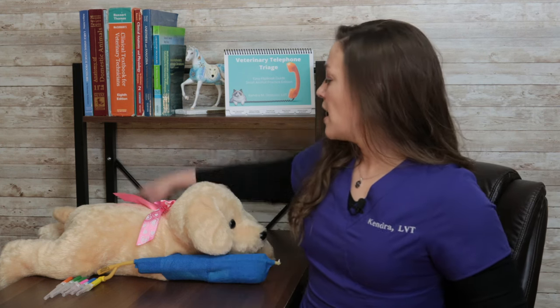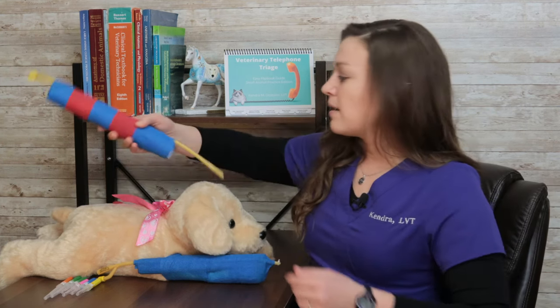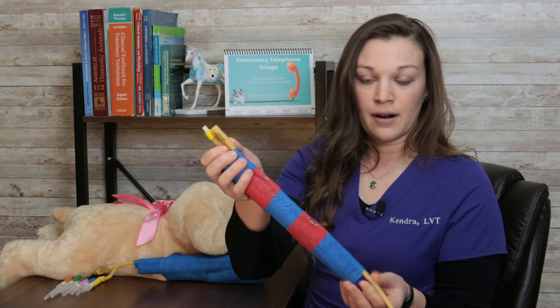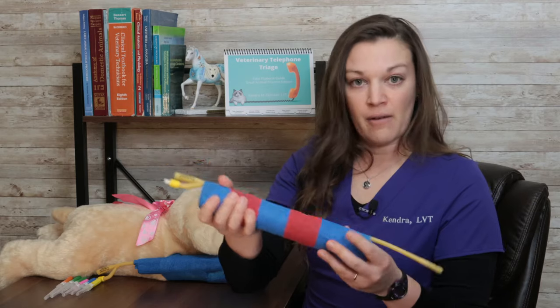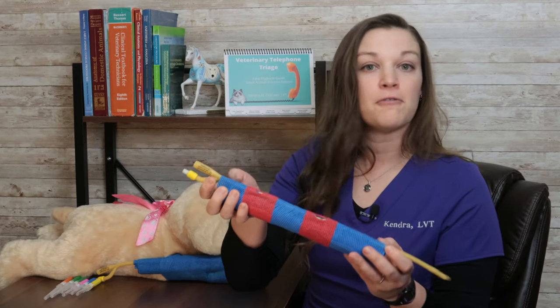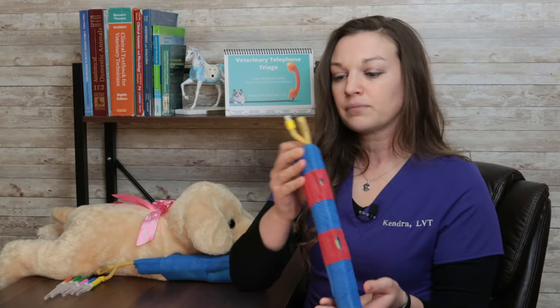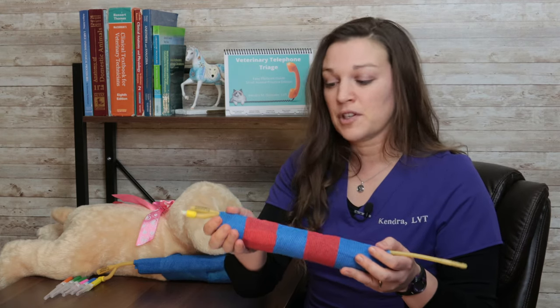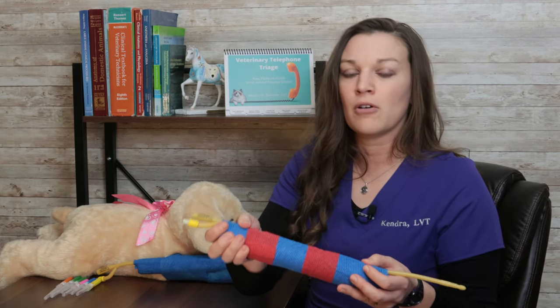Well, that wraps us up for this video, and the dummy veins that you saw today that we used, I made those pretty simply by using a rolled up magazine, a Foley catheter, and then just placing vet wrap over the top to secure the Foley onto the magazine. So it's a pretty cheap thing to make to be able to sort of mimic what you would feel for an IV catheter placement.